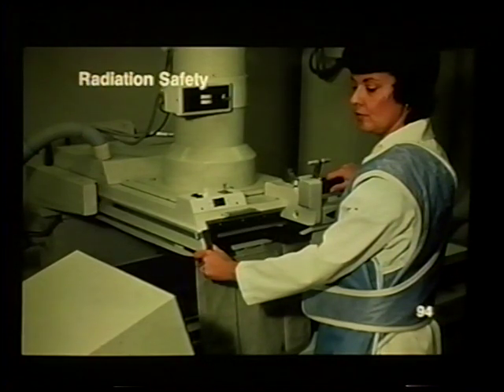Number 94. One of the oldest and most important quality assurance areas is radiation safety and monitoring. Lead gloves, aprons, gonadal shields, and other protective shielding devices should be inspected when new, at regular intervals during use, and as a result of reported problems. These devices may be visually inspected by checking for cracks or tears. They should also be checked using fluoroscopy or overhead filming.